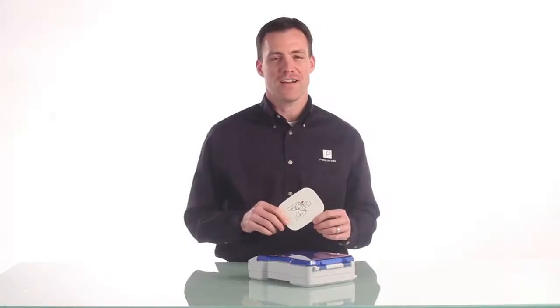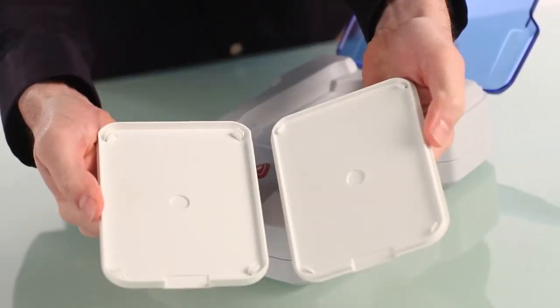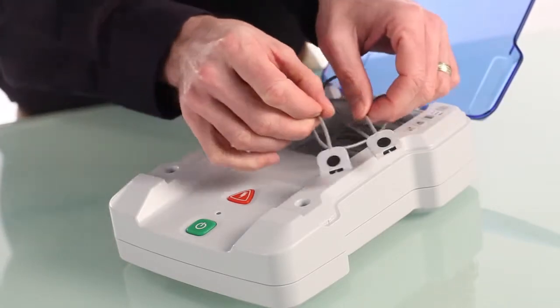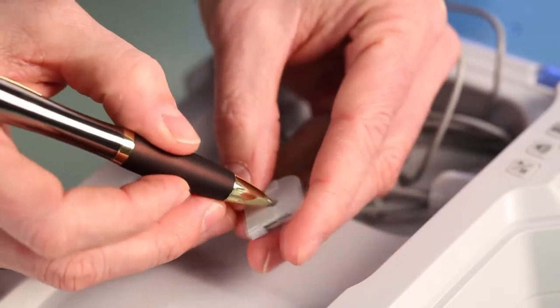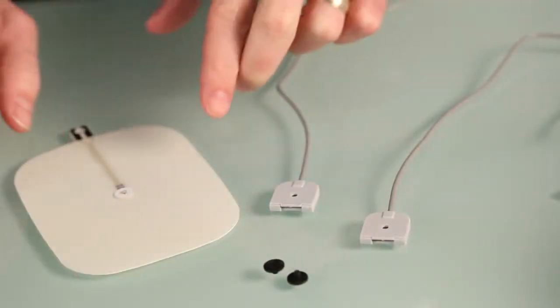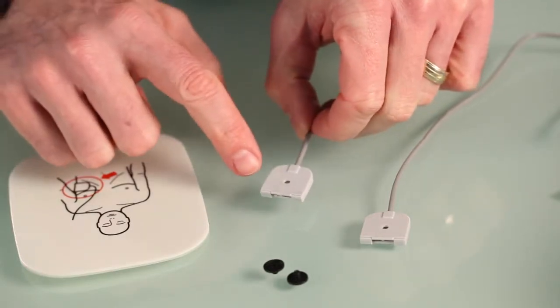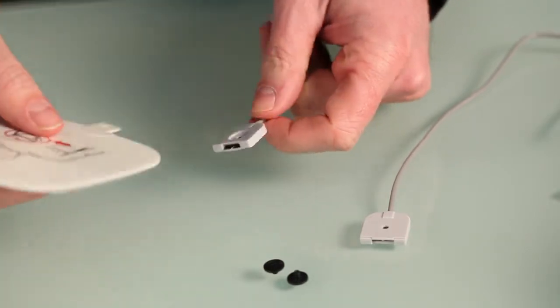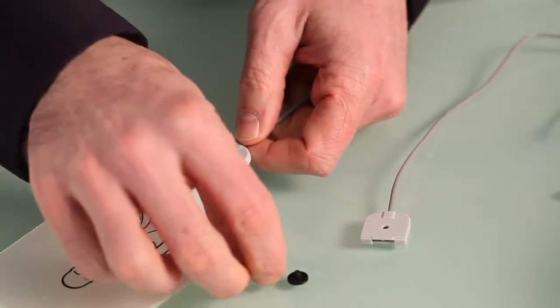Let's take a look at how you attach the pads to the cord. Remove and open the training pads case. Find the connectors at the end of the AED training cables. Remove the black pins from the connector. With the pad graphic facing up, make certain that the large diameter circle on the connector is also facing up. Then insert the pad into the connector lining up the holes. Replace the black pin.